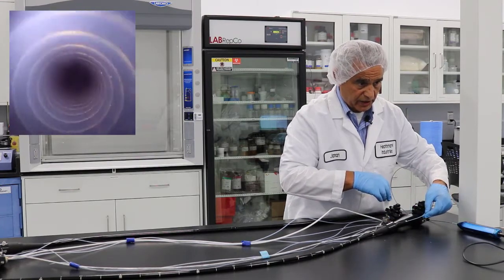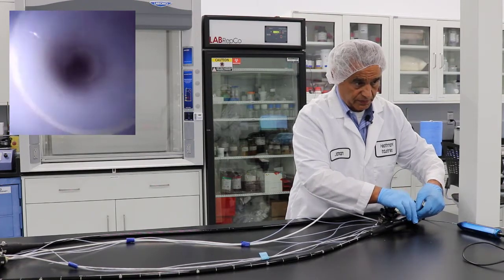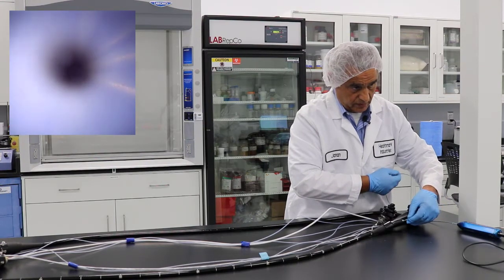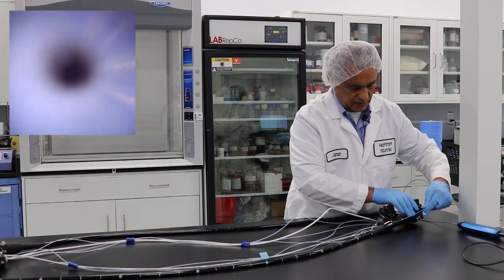You want to move at a really slow pace to make sure that you don't miss any of the debris that are inside the scope. Again, maintain a steady pace and look to make sure there are no debris inside.